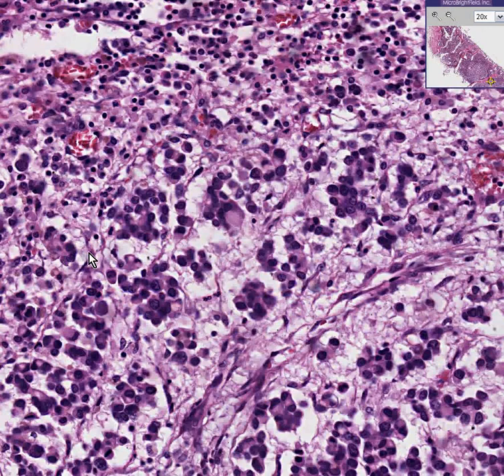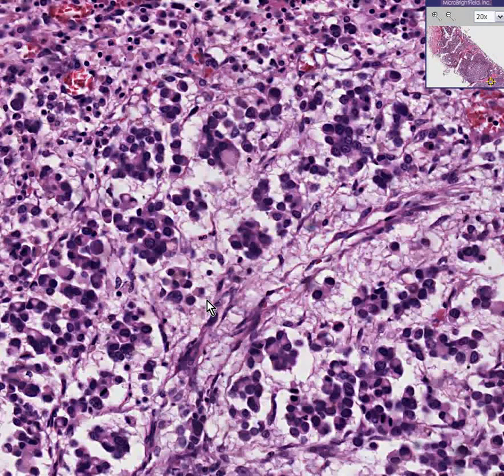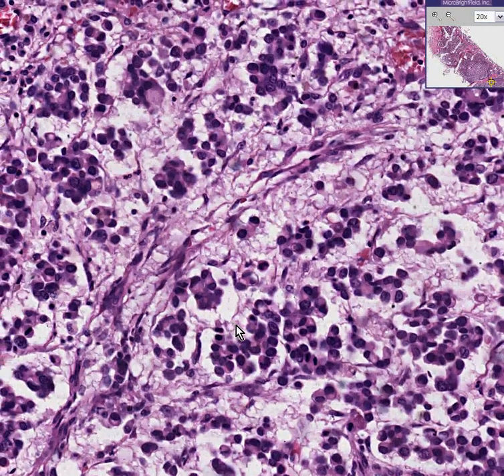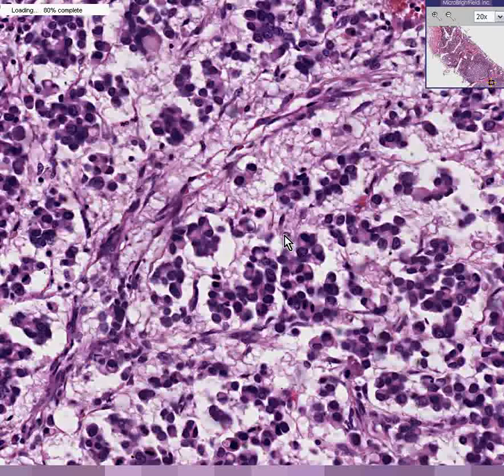Well, if you said that or observed that casually, you would be right, because this is a poorly differentiated adenocarcinoma metastatic to bone. And we talk about abortive glandular formation when we see a group of cells, perhaps like here, that look like they may be trying to form glands, or when we see cells that have little vacuoles inside of them, like there, like there, in which there may be some buildup of secretion, but certainly not behaving the way it should in real life.